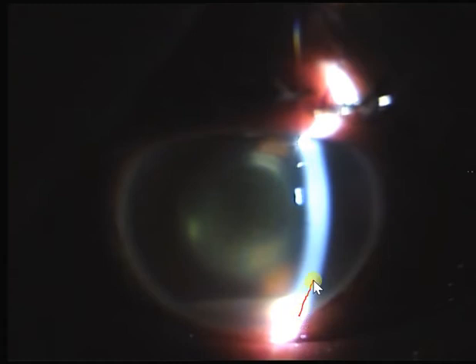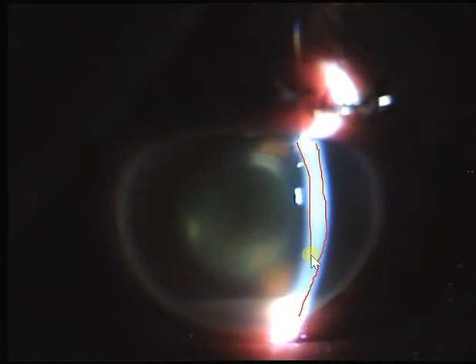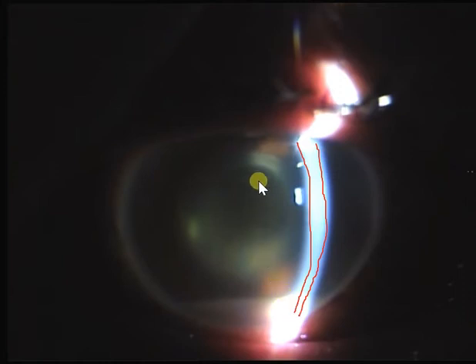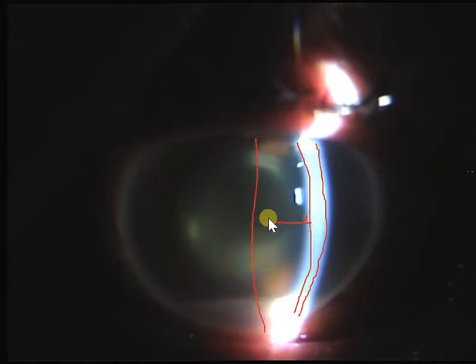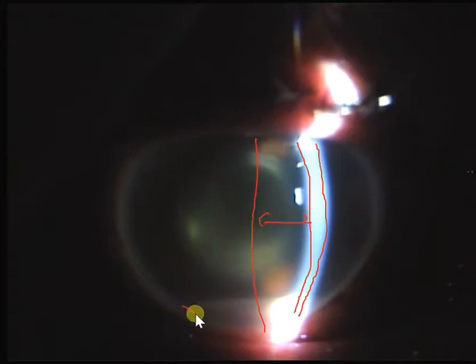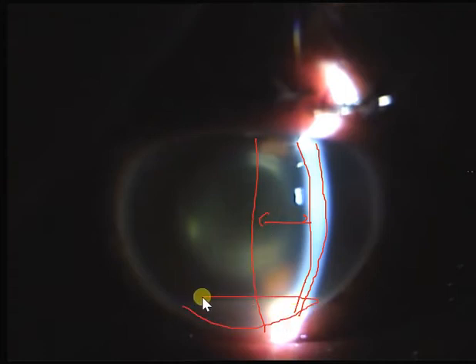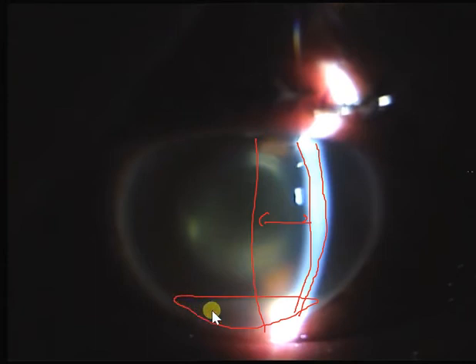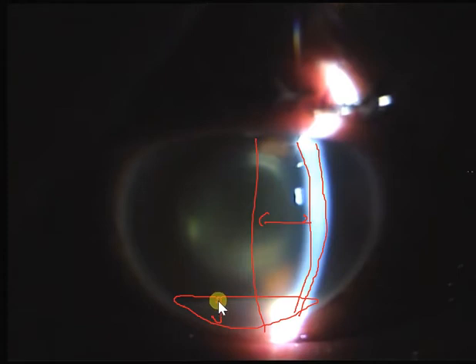This is an oblique view on the slit lamp. You can see the slit on the cornea. If I start drawing over here, this is the anterior slit going on the epithelium, this is the posterior slit going on the endothelium, and then you've got the posterior slit showing you the depth of the anterior chamber. Over here you've got this area of white material at the base which is called the hypopyon.